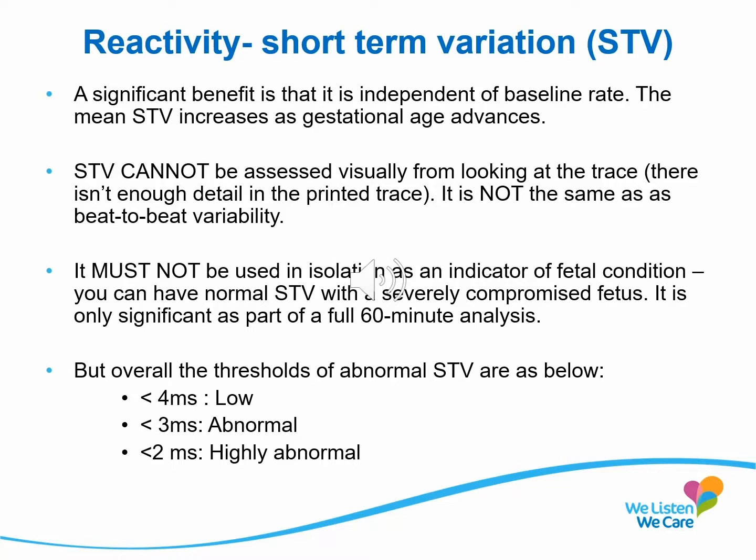It must not be used in isolation as an indicator of fetal condition. It is calculated by the computerized CTG software. You can have a normal STV with a severely compromised fetus, and hence it should not be used in isolation. It is only significant as a part of a full 60-minute analysis.